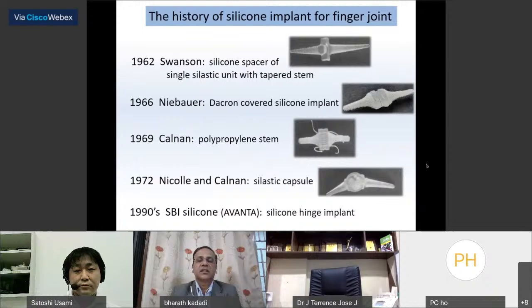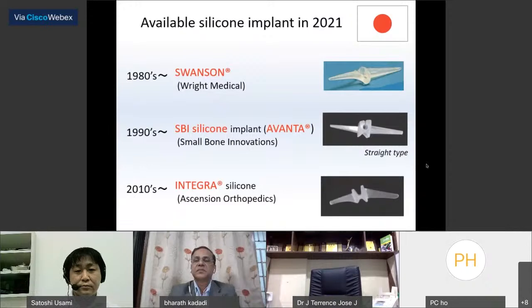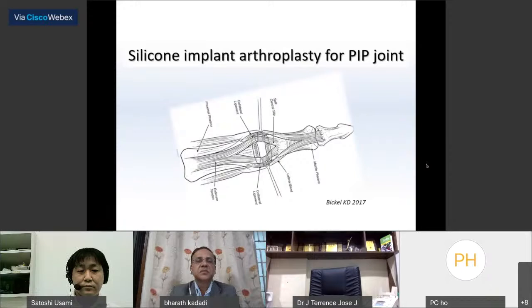Now in Japan, we can choose three types of silicone implant for small finger joints: Swanson, Avanta, and Integra. In our institution, Swanson and Avanta are used for DIP joint arthroplasty, and Avanta and Integra are used for the PIP joint. First of all, I am going to show our clinical cases of silicone implant arthroplasty for PIP osteoarthritis.